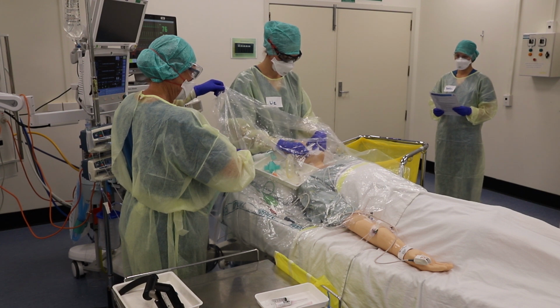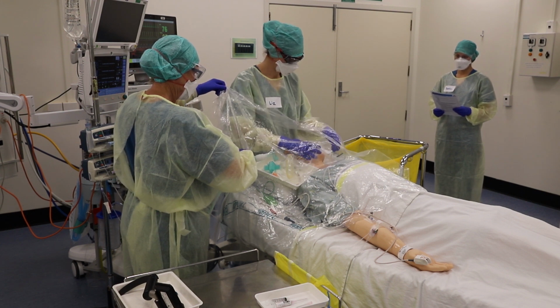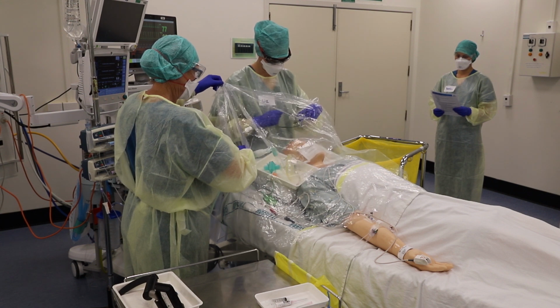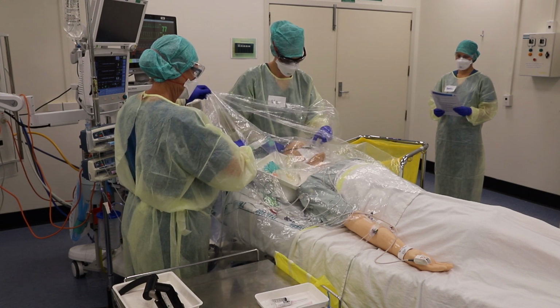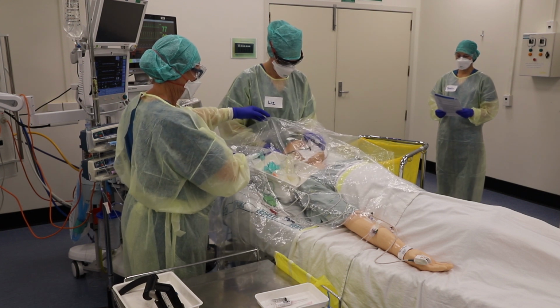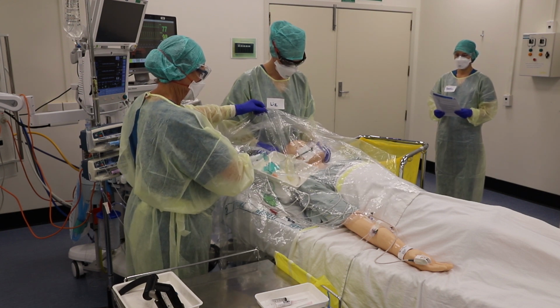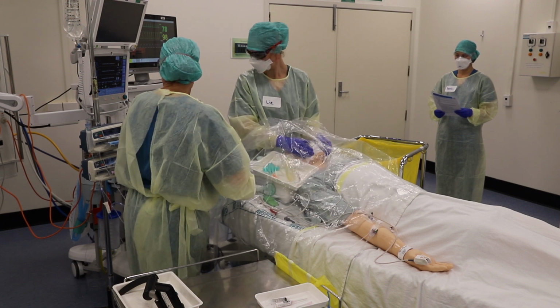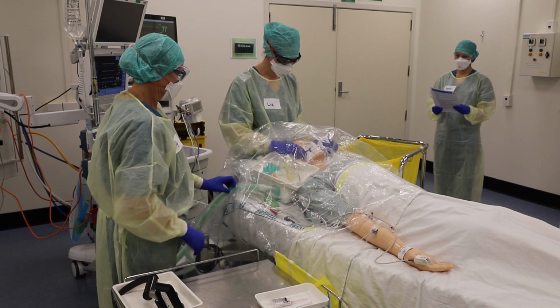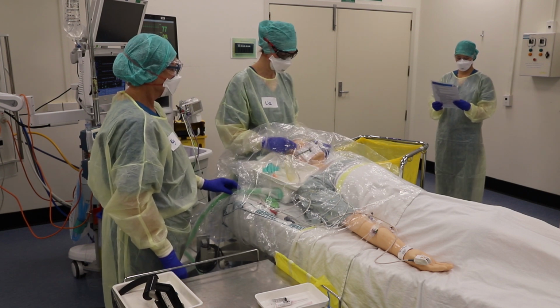Just putting this different mask on your face, Simon. That's great, so we've got both masks on the patient.